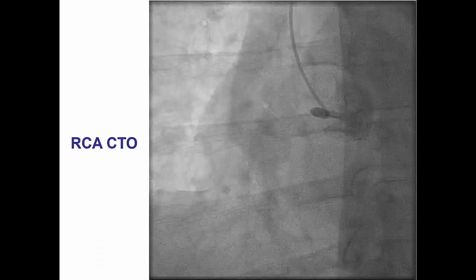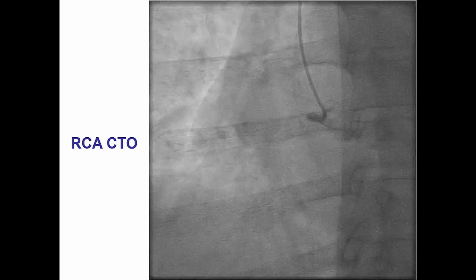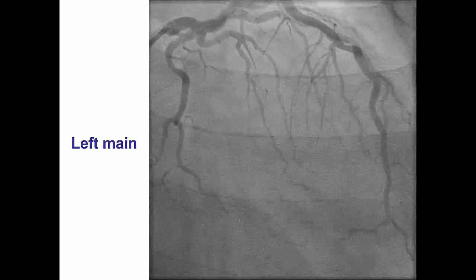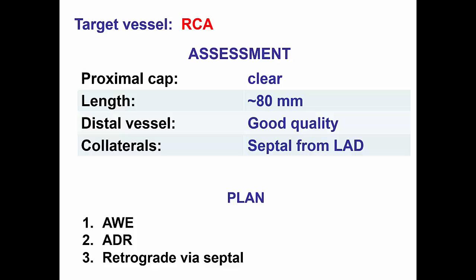The patient had an ostial right coronary artery CTO without significant disease in the left main system and retrograde filling via septal collaterals. There is a clear proximal cap; however, it is a very long occlusion. The distal vessel is of good quality with reconstitution of the distal bifurcation, and there are septals from the LAD.